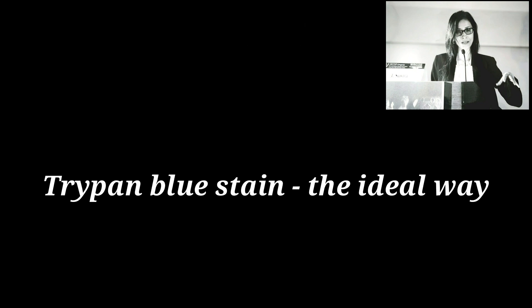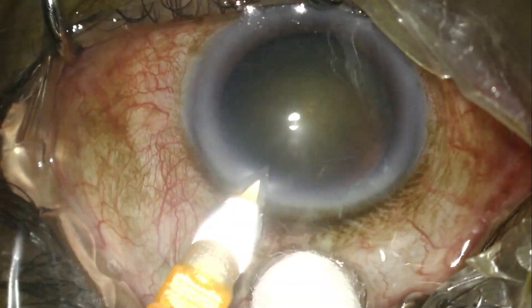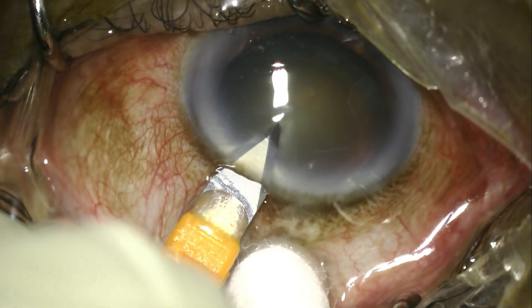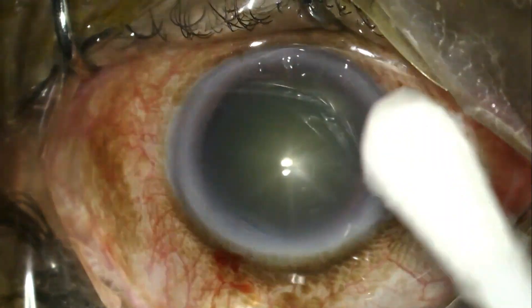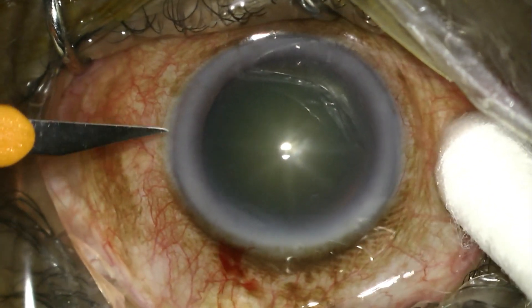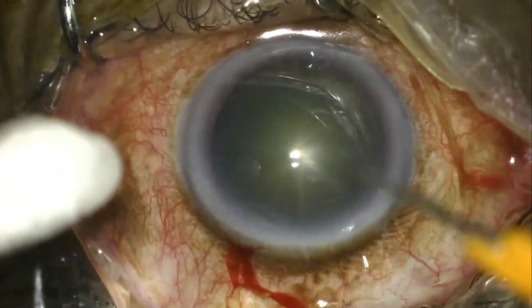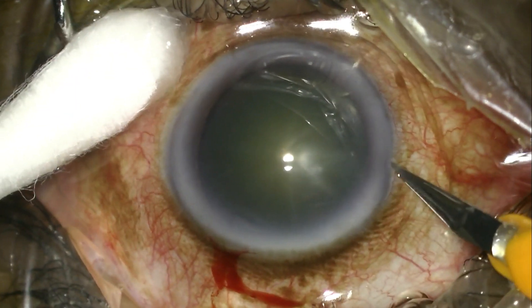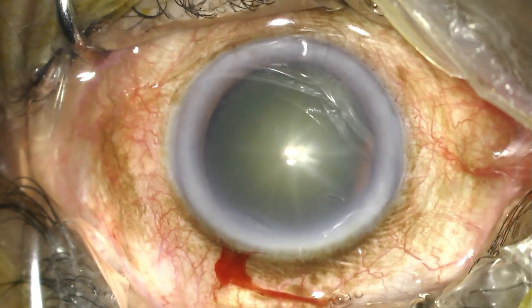In the following video we'd like to share what we consider the optimal technique for staining the anterior capsule with blue dye. The surgeon may choose to stain through the sideport incision, but I personally prefer to make the 2.8 keratome entry as well as both sideport entries with minimum loss of the anterior chamber, because injecting through the main 2.8 incision gives a little more room for fluid to go in and out of the eye with ease.